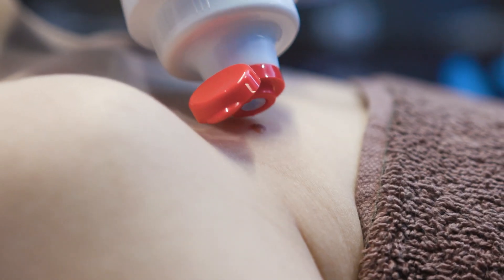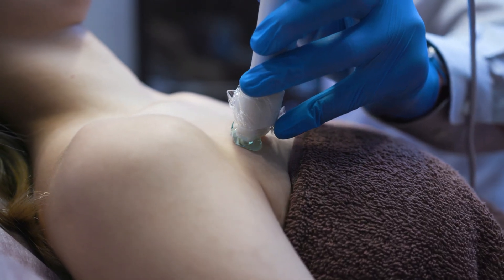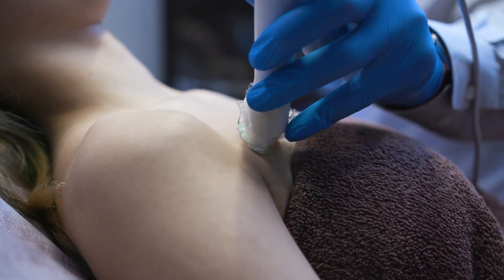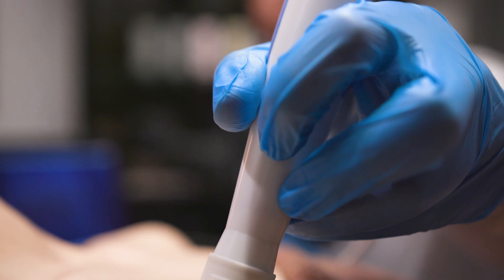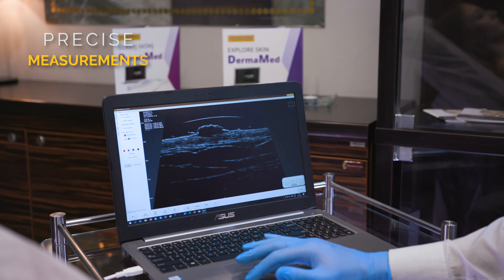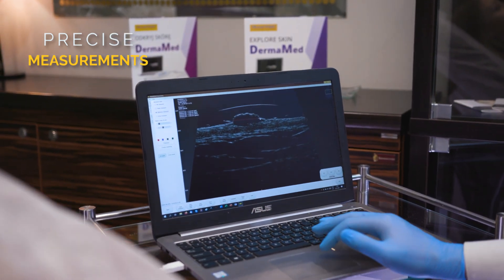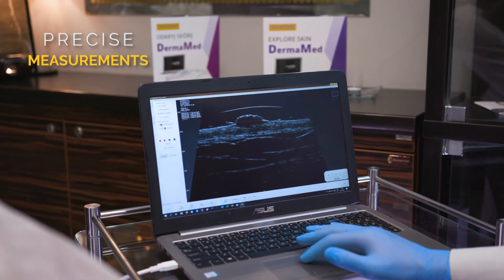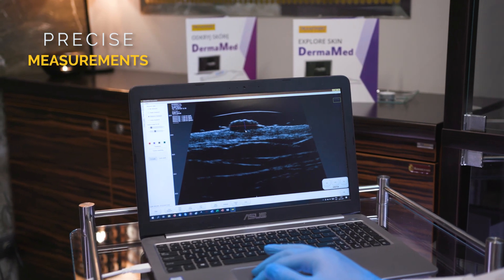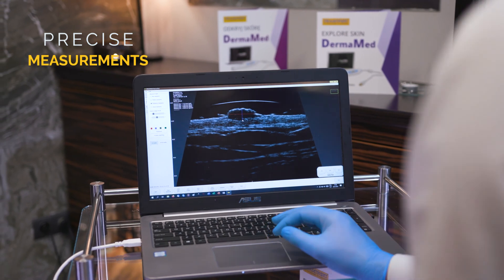Let's now see what the skin mole looks like on the screen. Here we have an image of the mole. Let's measure it. DERMAMET shows a length of 3.12 millimeters and a depth of 2.26 millimeters.